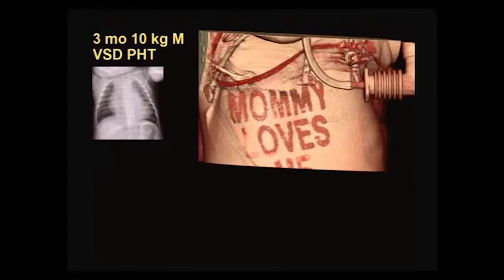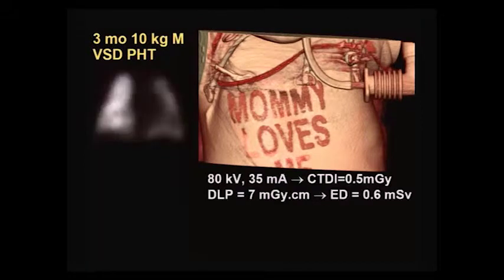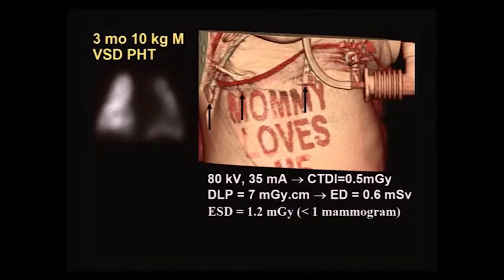So we go back to our young child, the 3-month-old, 10-kilogram baby with ventricular septal defect and pulmonary hypertension and asymmetric lung perfusion. And we did the measurements. We measured it on the skin. We measured it directly. We correlated. It was in the order of 1 mammogram worth of radiation exposure over the skin.